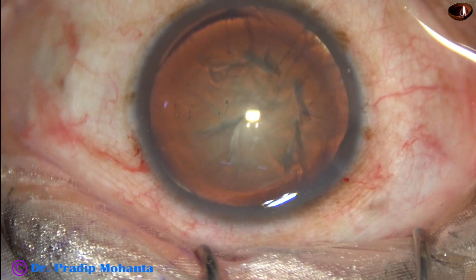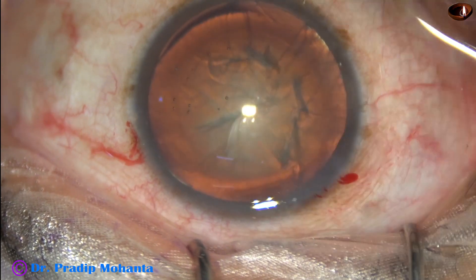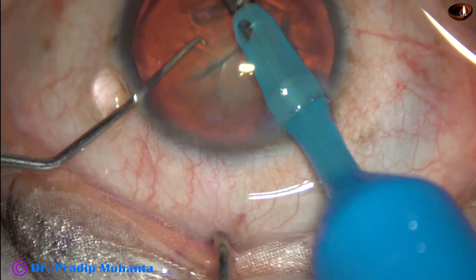Let's go again to fill up the anterior chamber. Now let us see direct chop. The phaco needle goes in with its bevel down.